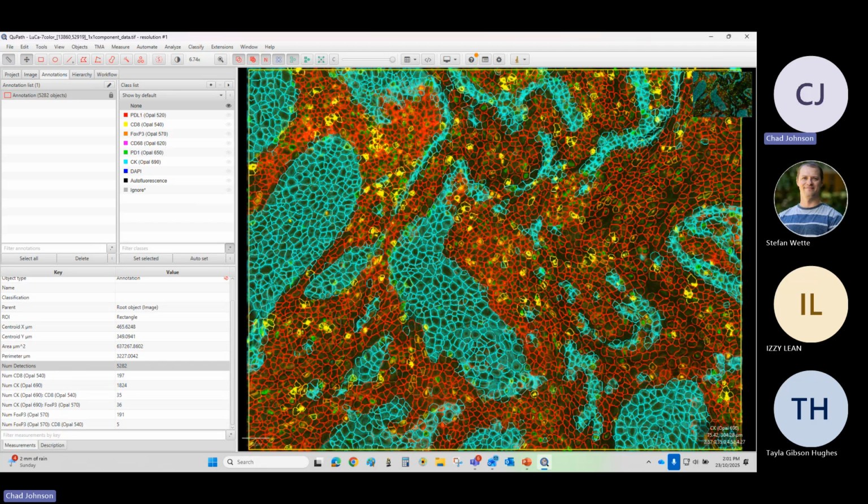Now there may be variations amongst your samples, so it can be difficult to get a working model off a single image. We've used the same image to do detection in that exact same image. What you would typically do is train the model on multiple images, multiple data sets. So 5, 6, 7. Again, more is more. The more data sets you use the training algorithm on, the better it gets.